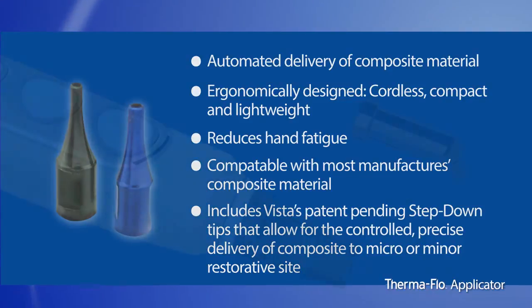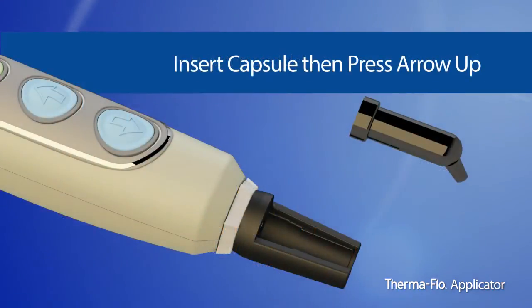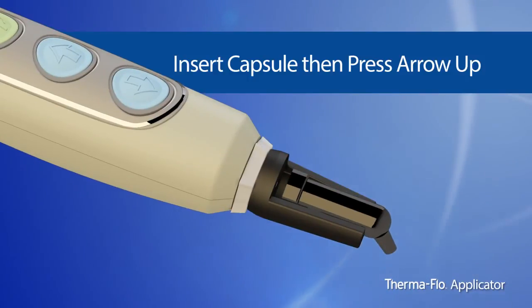To operate the handpiece, insert your preheated capsule in the capsule holder and press the arrow up button until the handpiece plunger fully engages the capsule.